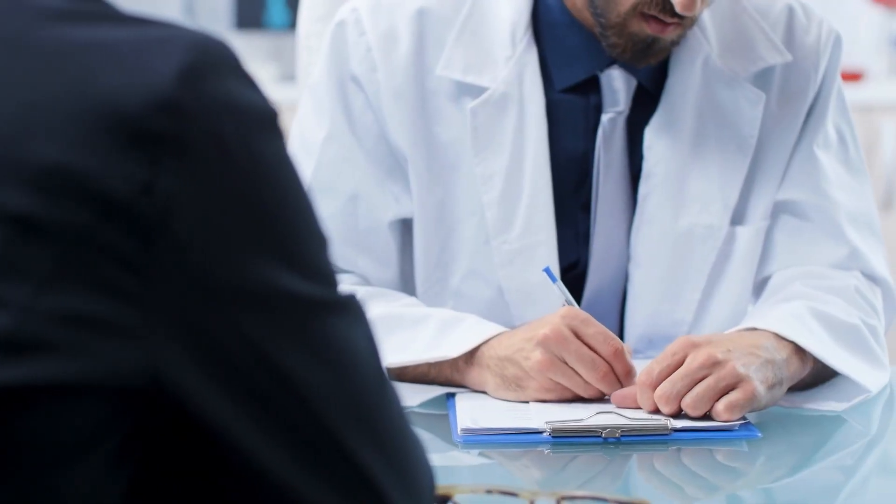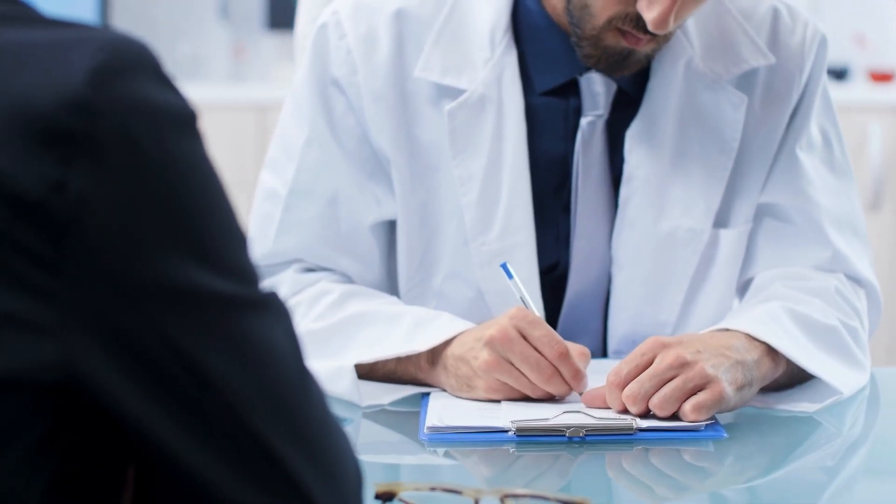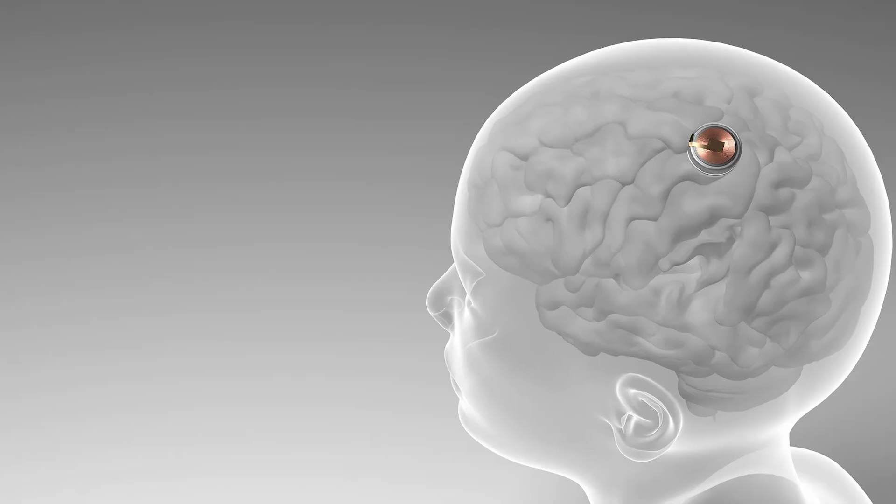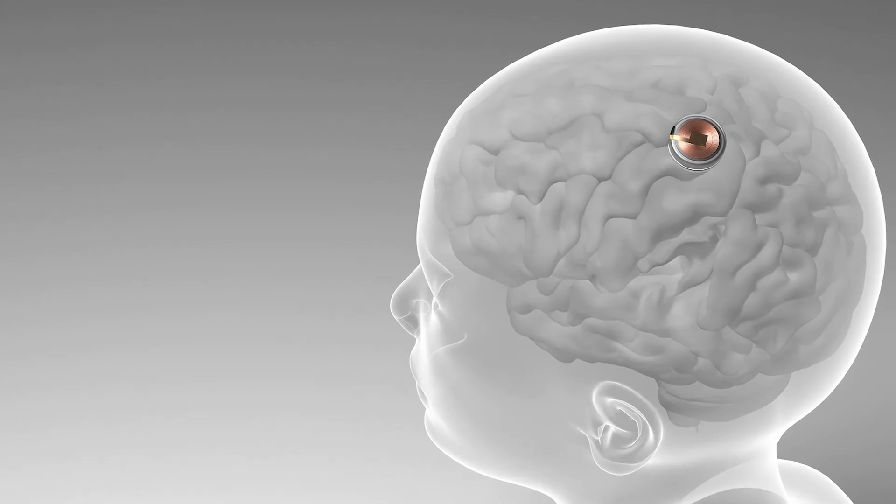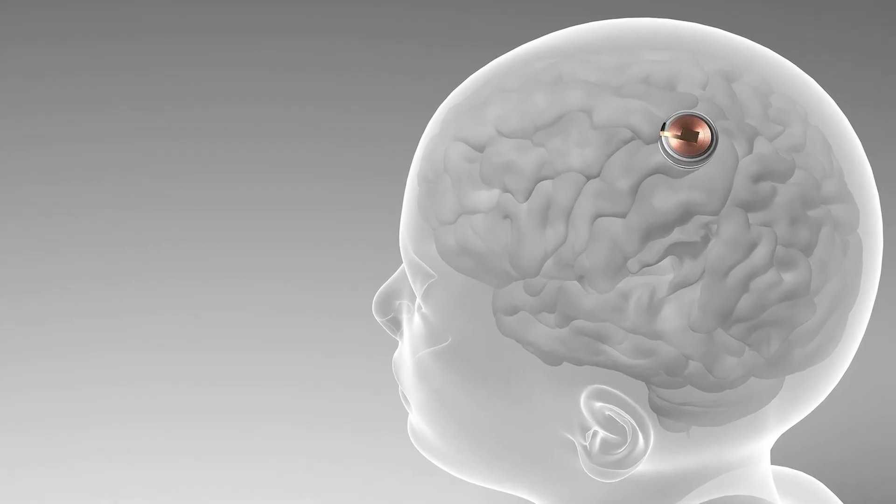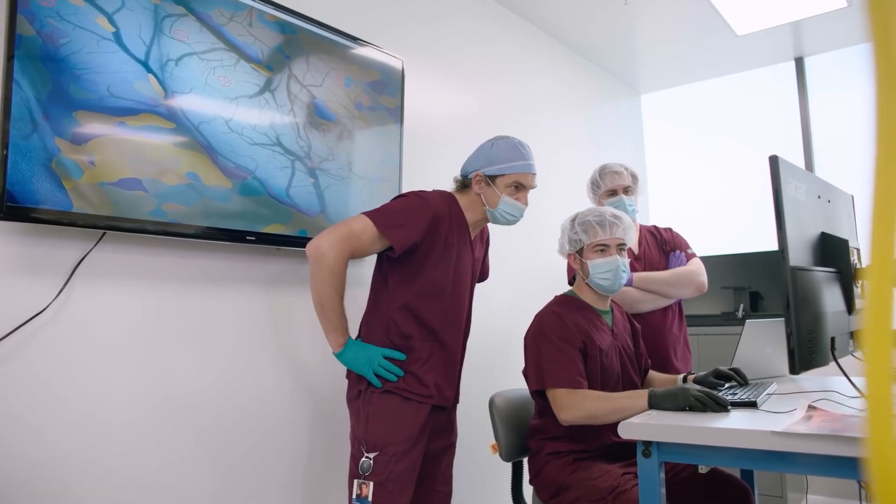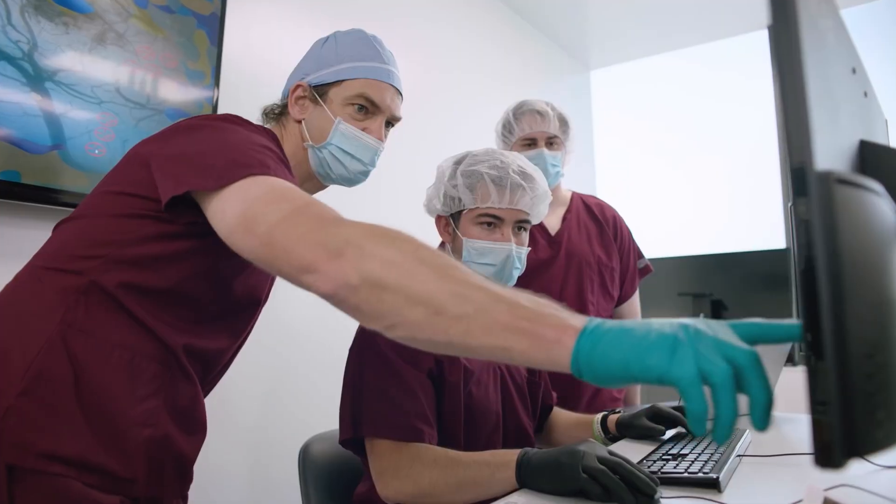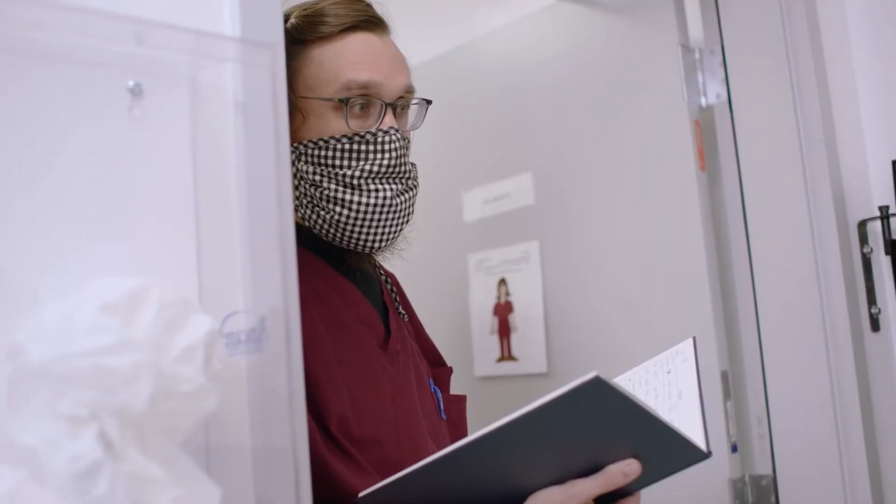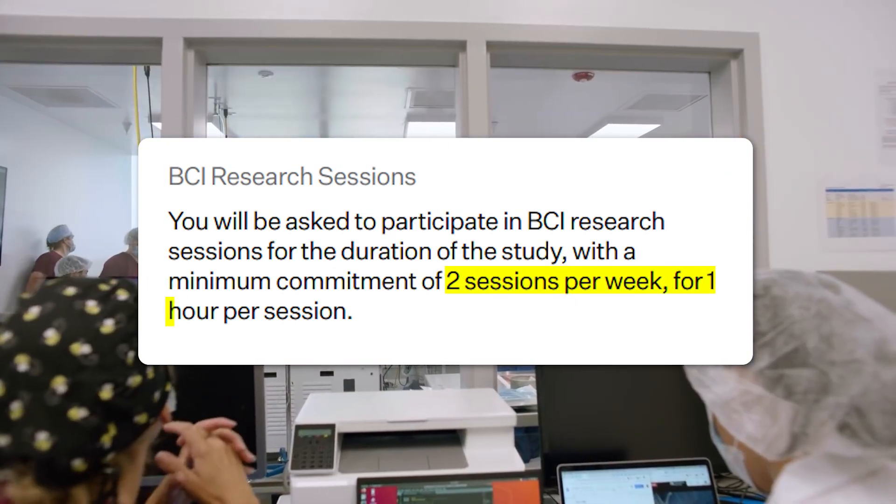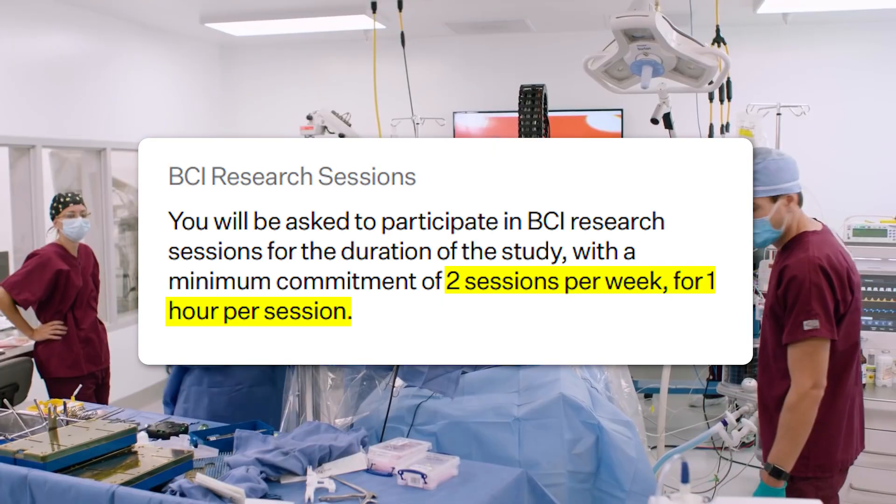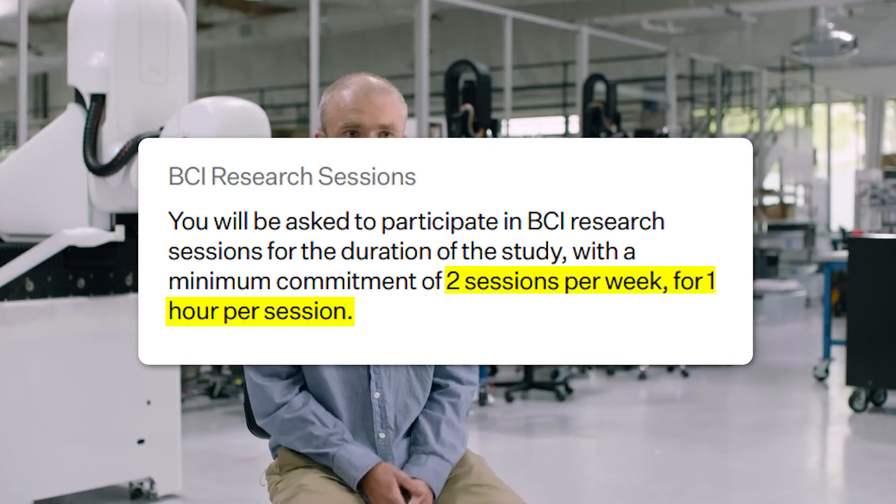Patients will check in with a medical team every two months to monitor progress and ensure the Neuralink device continues to work as intended. One hour BCI research sessions with the Neuralink team will be completed at least two times per week for every patient for the duration of the 18-month primary study.